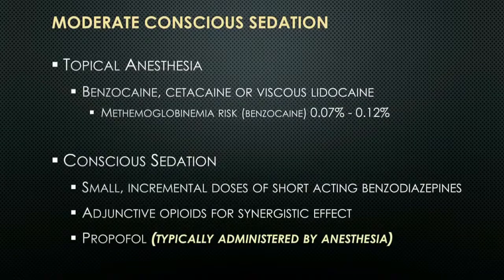You should always be aware of the posterior pharynx. You should also be aware that there is a small risk of methemoglobinemia, defined with benzocaine in particular, but it's very rare. But if the patient becomes hypoxic, that is something to be conscious of.